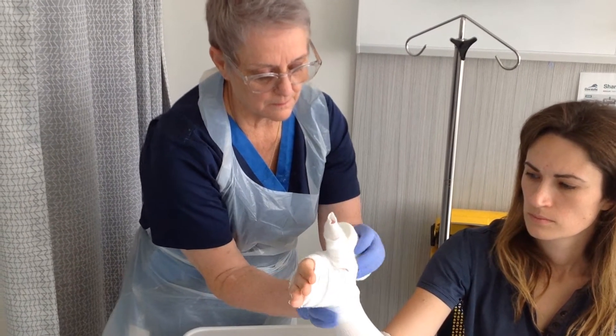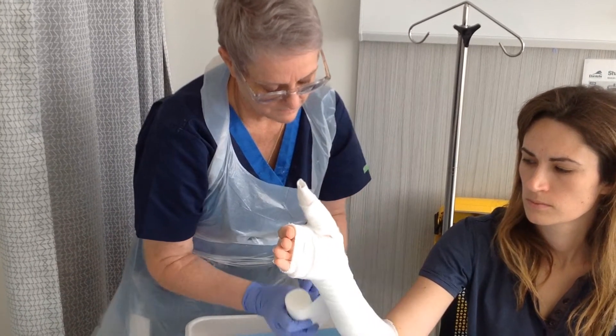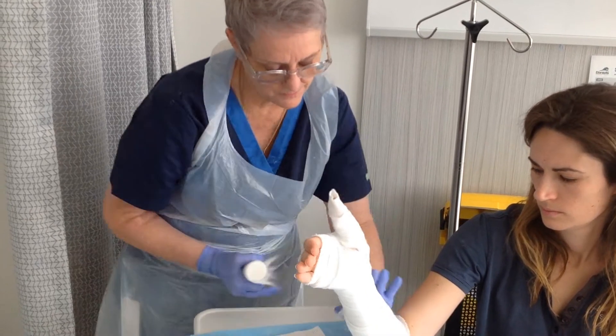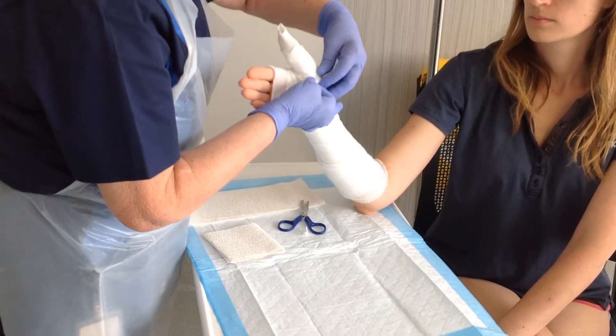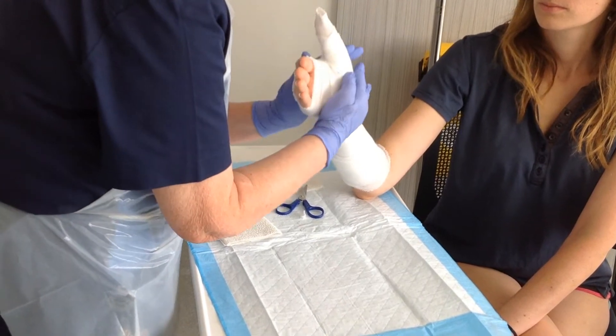Just bend your arm down that way a little bit — that's it — then come down, and twice round the bottom to finish off. So that's what the arm should look like. Just check we haven't got any open areas here, and tether some of the padding to cover any open areas you spot.